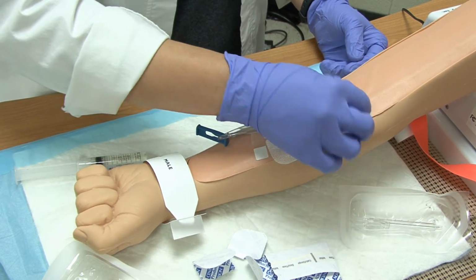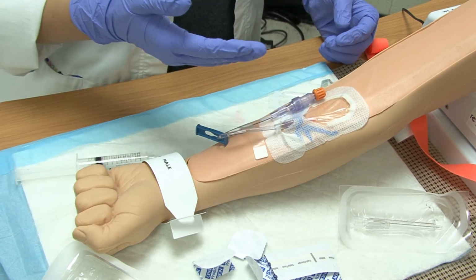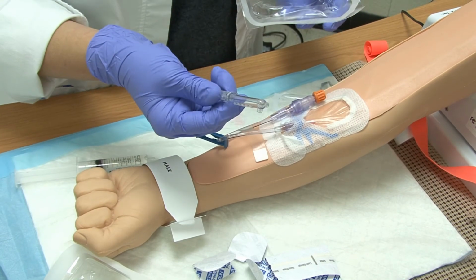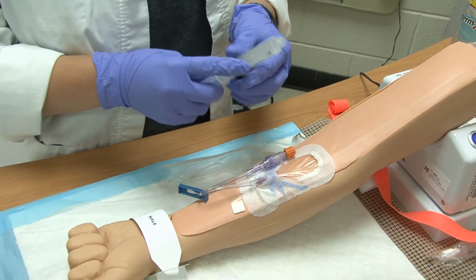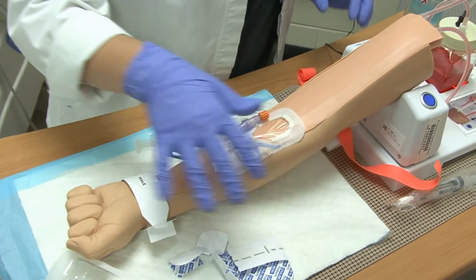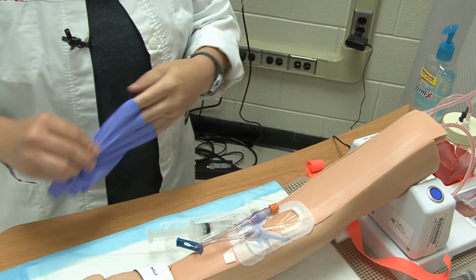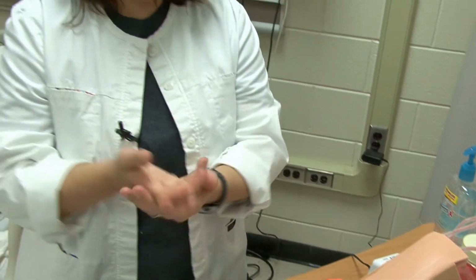Now that we've got it all secured and it's labeled, what I'd want to do is gather my equipment. All of these things can go in the trash except for your actual sharps, which should go in your sharps box. If your saline flush has had any blood exposure in it, then you might need to put that in the actual sharps box. The rest of the stuff can pretty much go into the trash. I would want to take off my gloves once I've disposed of everything, and then foam.